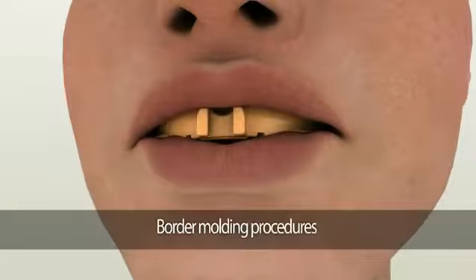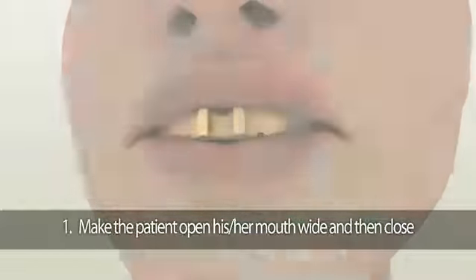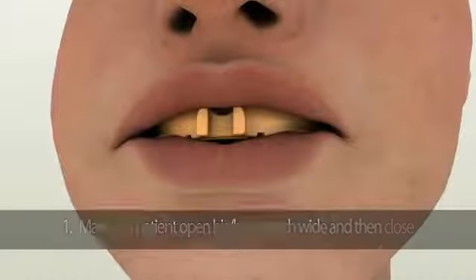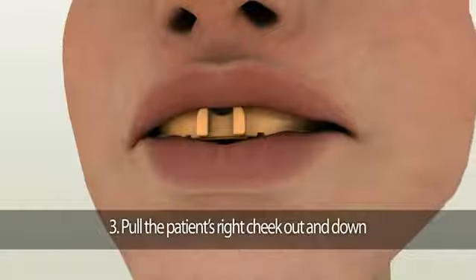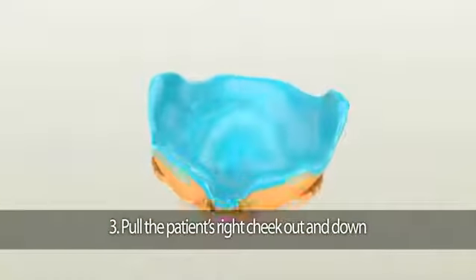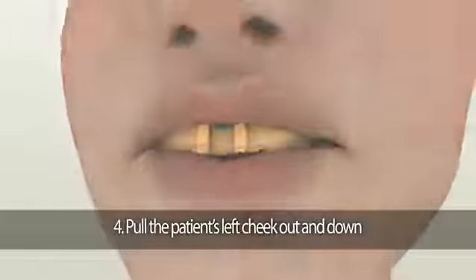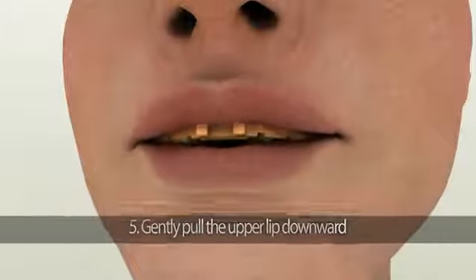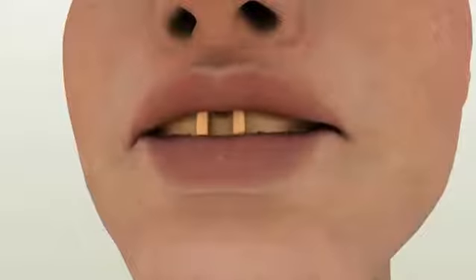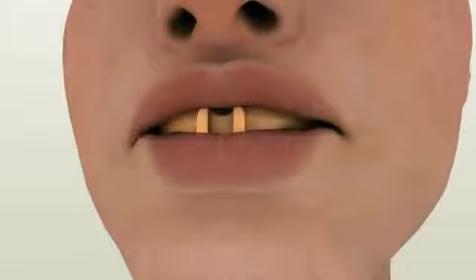Once the tray is seated, perform border molding procedures. First, have the patient open their mouth wide and then close. Second, have them move their jaw side to side. Third, hold the patient's right cheek out and down. Fourth, pull the patient's left cheek out and down. Fifth, gently pull the upper lip downward so the membranous attachments and frenums are activated.